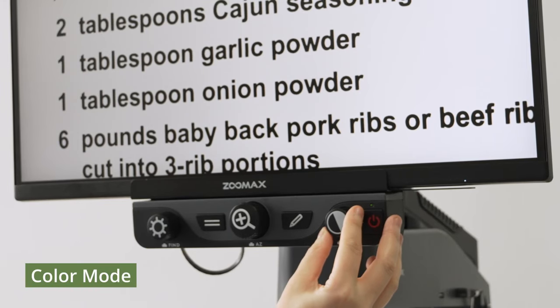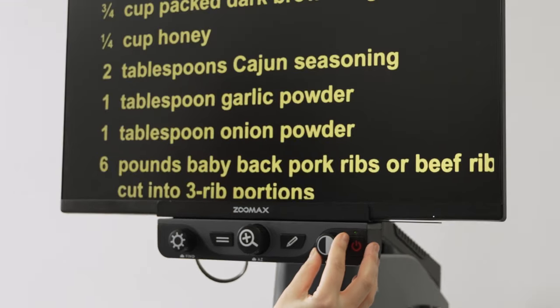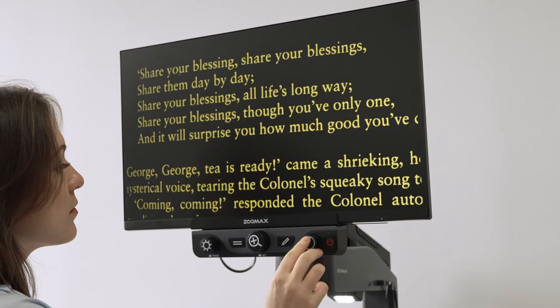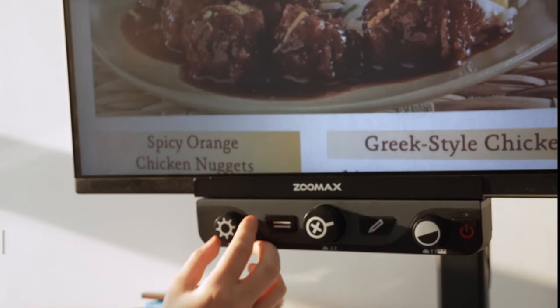Color Mode Dial: switch color modes by rotating the Color Mode Dial. Luna HD 24 Pro has True Color and 4 high-contrast colors. For users with color weaknesses, high-contrast colors help them see more clearly. Short-press the mode button in any color to quickly return to True Color Mode.